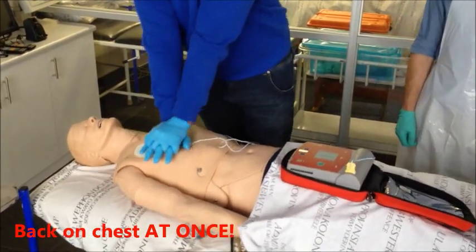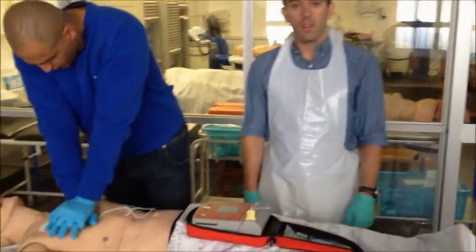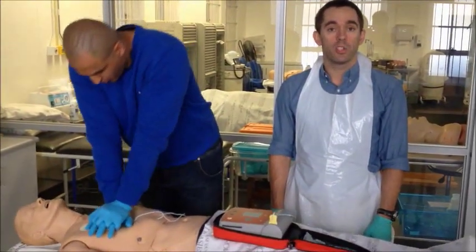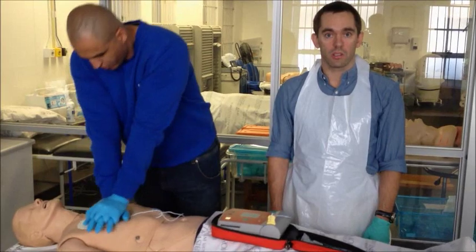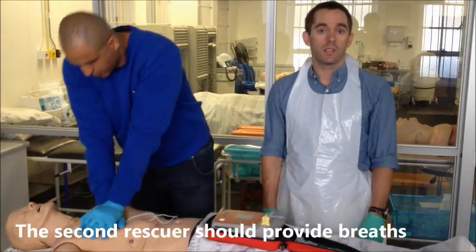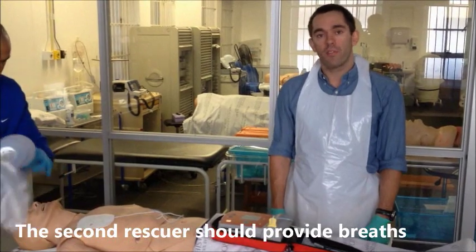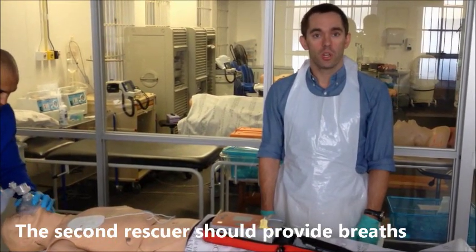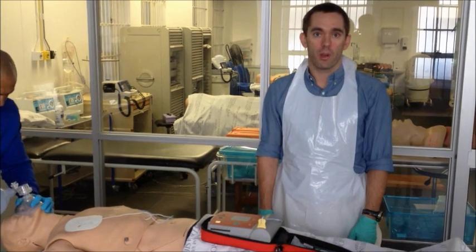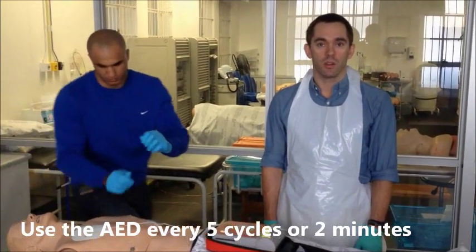Start CPR. The pulse check and delivery of a shock is a good time to switch rescuers. This allows your rescuers to last longer as they don't tire as quickly. After a further 5 cycles or 2 minutes of good quality CPR, you will repeat the process by using the AED again and switching rescuers.